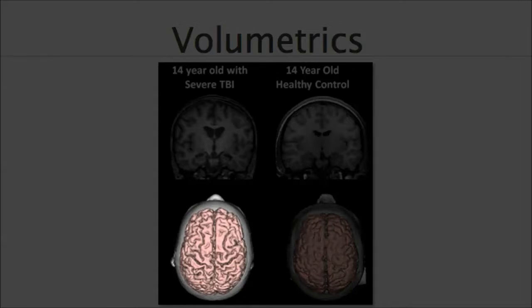Look at what we call the sulci, or the folds of the brain. See how much more defined they are. They're darkening. They're actually shrinking. It's actually imploding and shrinking as volume is decreasing, and we can see more defined the sulci of the brain. A very bad sign. In fact, this is such a global effect, perhaps the damage in this case could have been anoxic, lack of oxygen to the brain, as opposed to one discrete area being damaged by a strike.